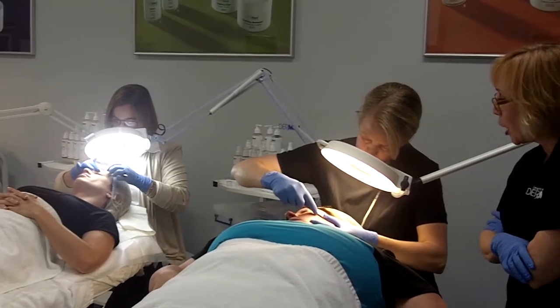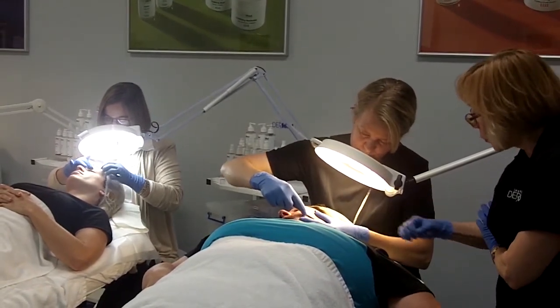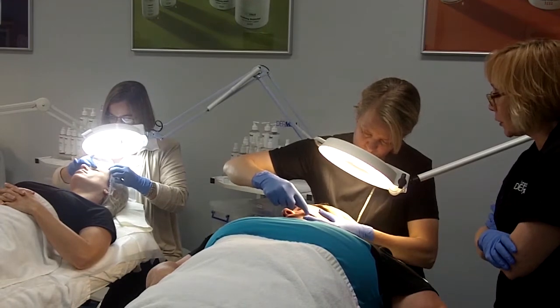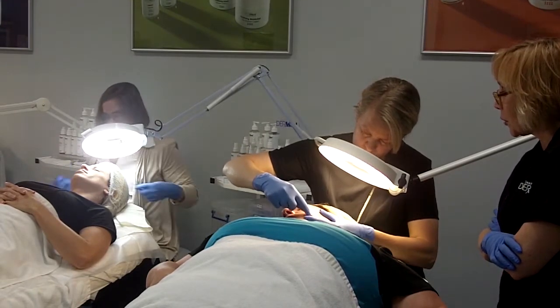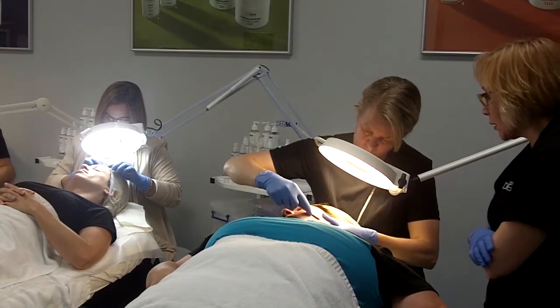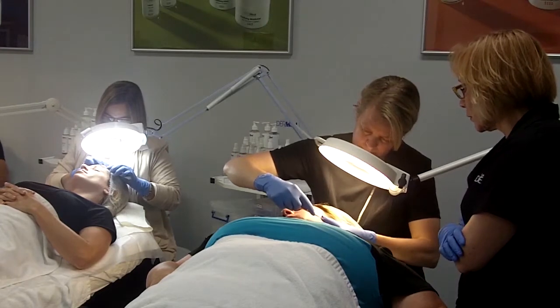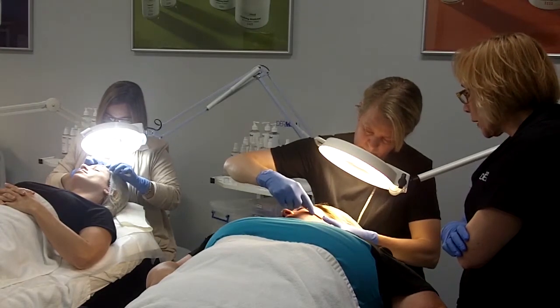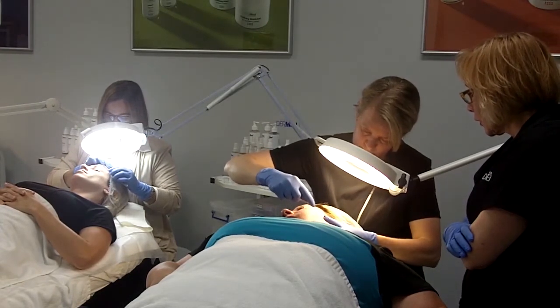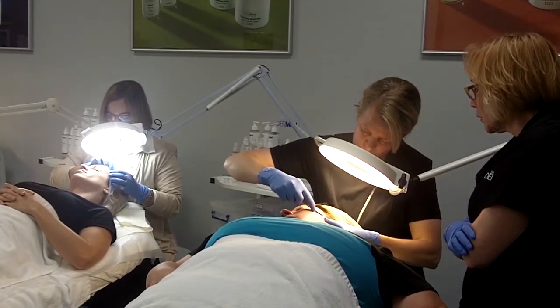You don't want to get too choppy. Okay. So longer, more gliding feels better. Slow down. Pressure. If you're going fast, you can't have the pressure that you need to get the peel. See, that's what you want right there. Feels better. You're going to get more results. And pressure. Much better.